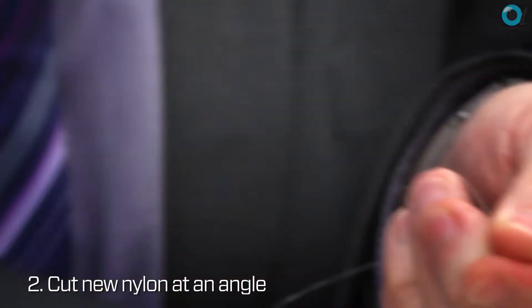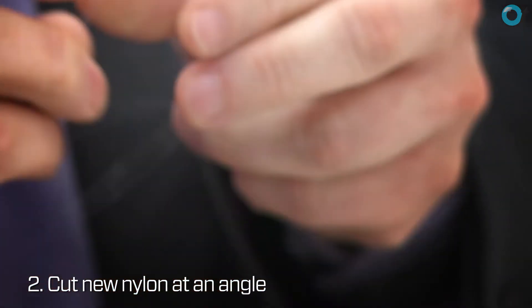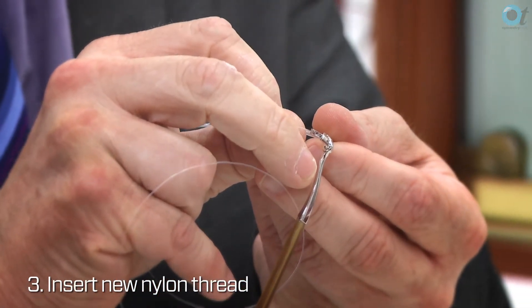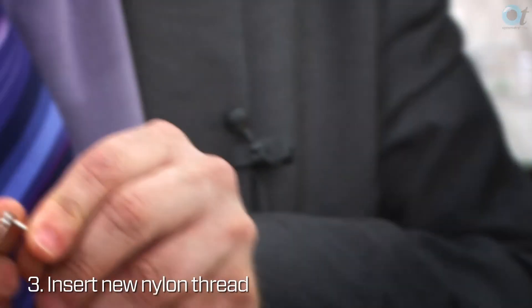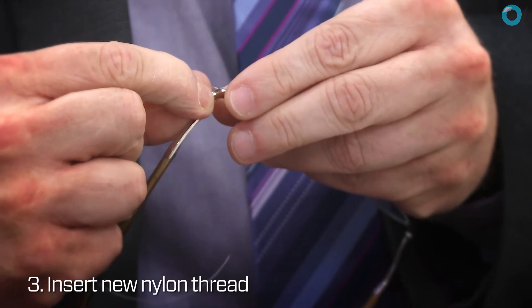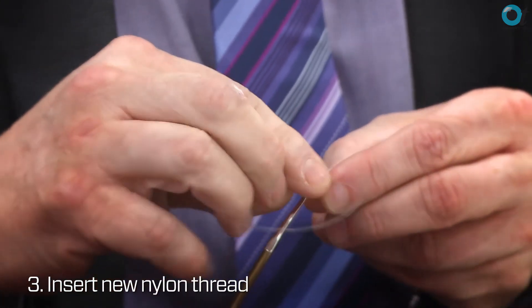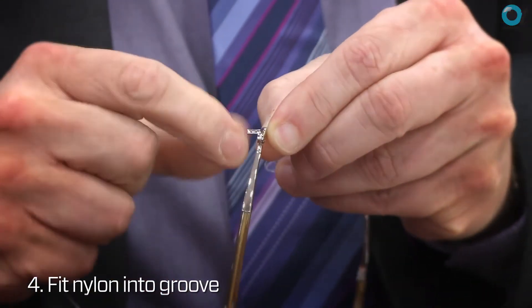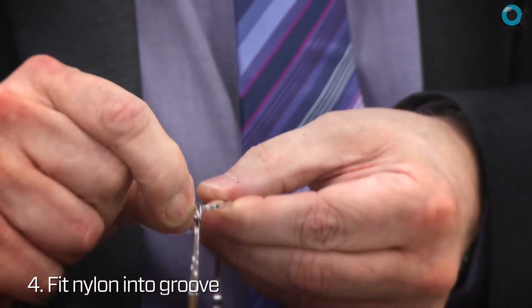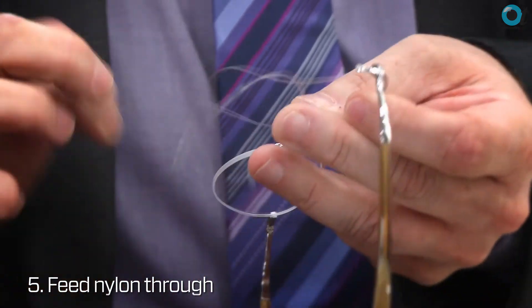All we need to do is feed a new nylon through and just cut it on an angle so you get a sharp point, which will make it easier to thread through the holes. I tend to work from the outside to the bridge, but it doesn't really matter — most people just do whatever they get used to. First of all, you need to thread enough nylon through to lock into the frame and fit into the groove, then feed the nylon through the other holes on the other side.